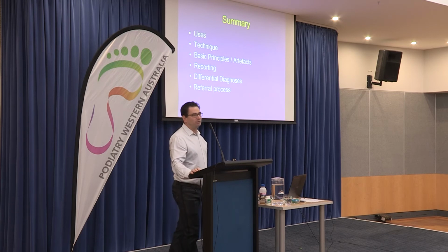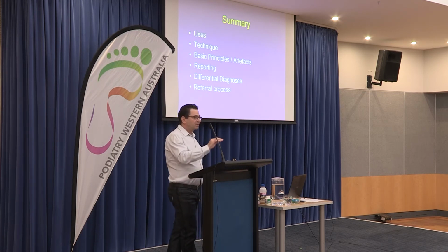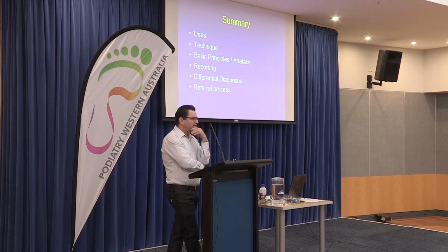And sometimes you appreciate tendon tears a little bit better. In the plantar fascia itself, everything just looks grey and miserable at MR, but you sometimes get a better idea at ultrasound about whether there's a tear there or not, and you can poke on it and see whether it moves and things like that.